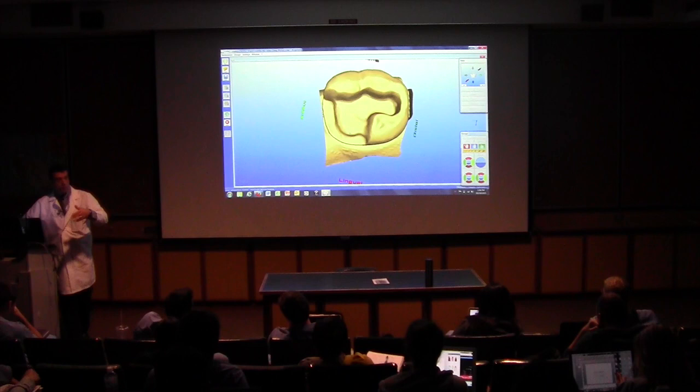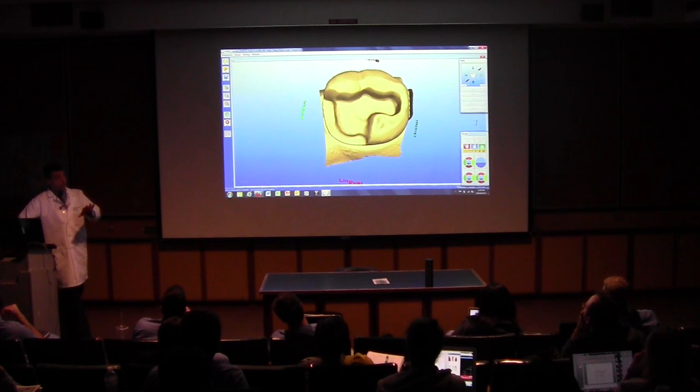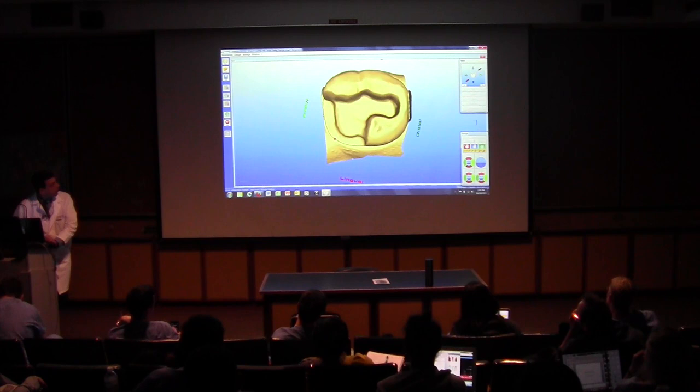Remember, this is a supragingival prep, right? It should be super easy to find the margin. The computer can find the margin itself. If you have a subgingival case, where you still have enamel, it might be hard, so then you have to use the manual margin finder. If you watch the video, it gives you more details on that. Do you still see my cursor here? Double left click. I now have a red ball.